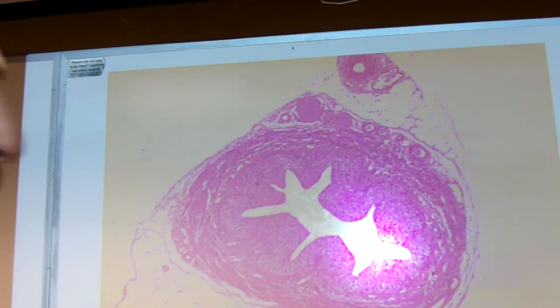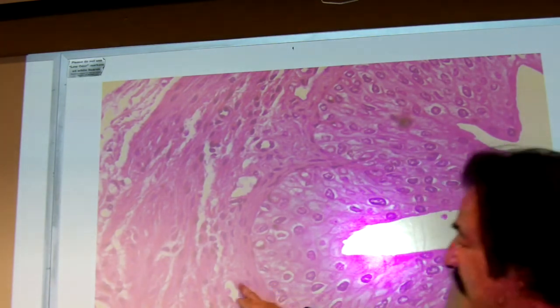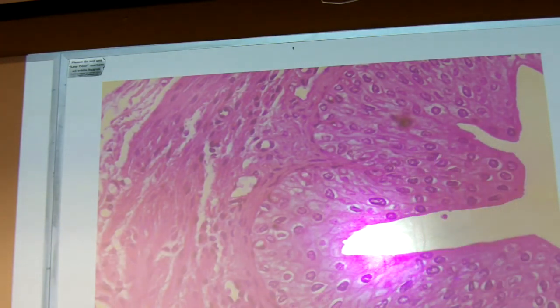That covers our epithelium. We are now ready to do some connective tissue. And I don't have to draw for connective tissue, which is pretty cool because, a blow-up of the transitional epithelium. Sorry about that. Lumen over here, epithelium, connective tissue. Sorry you don't get to see it in a state of transition. Maybe there's a video on that somewhere.